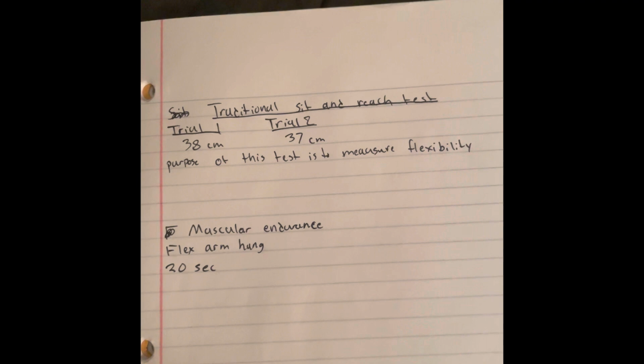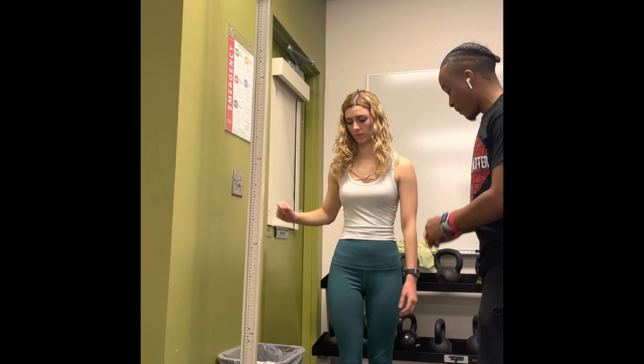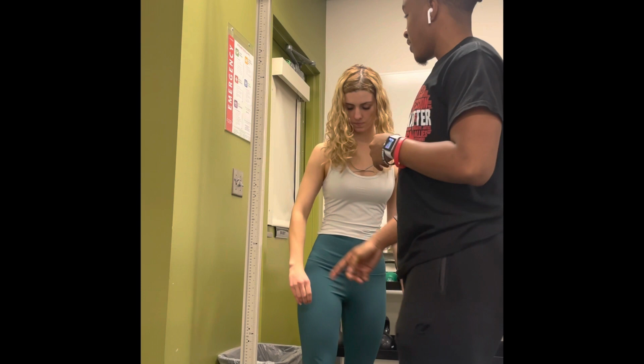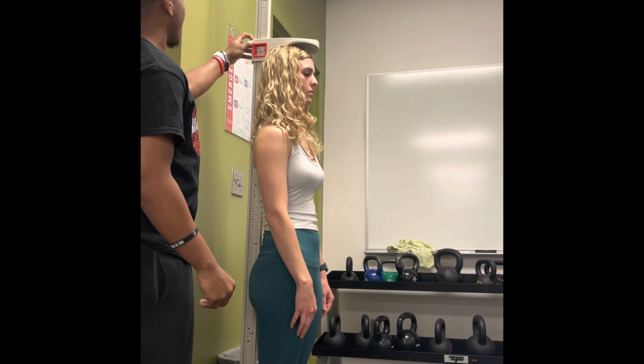So today we're going to take your height, okay? To get the BMI, which is basically your body mass index, we have to take your height first, and then we're going to take your weight. But right now we're going to take your height. So I'm going to have you take your shoes off for me. Okay, so today we're going to put our feet flat on this plastic thing right here and back towards the measurement. I'm going to slide this down for you to reach the top of your head. Alright, you can go ahead and step out for me.